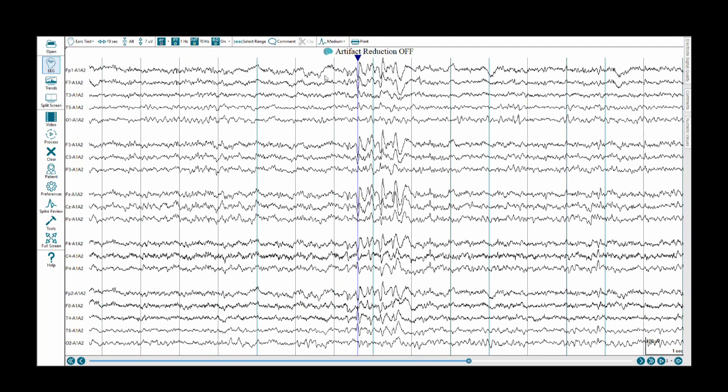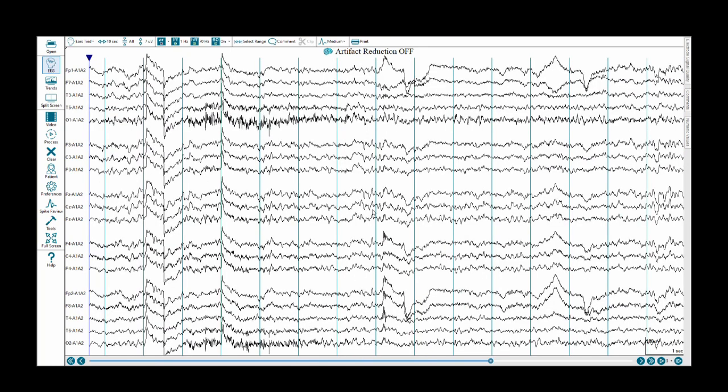There's a positive dipole over FP1, F7, a little bit at T3, strikingly so at F3 as well as C3, FZ, CZ, F4, and FP2. All right, that's it for today's module.